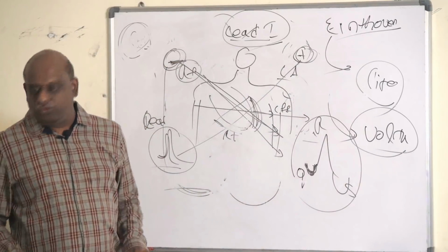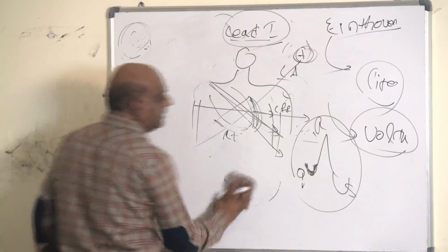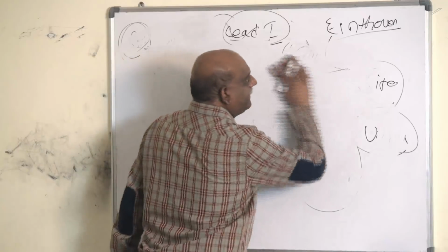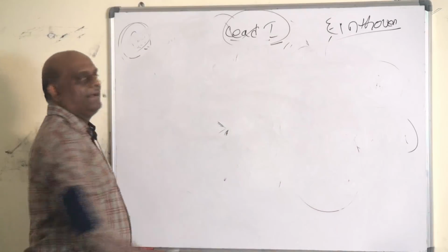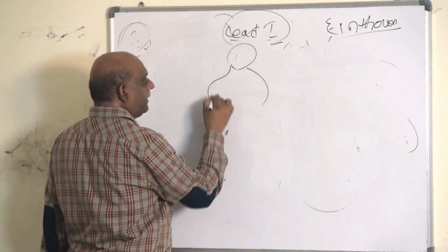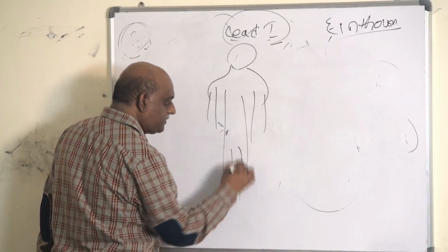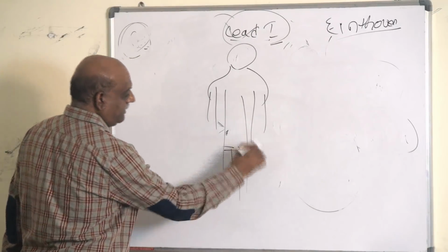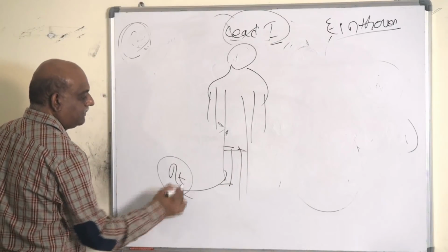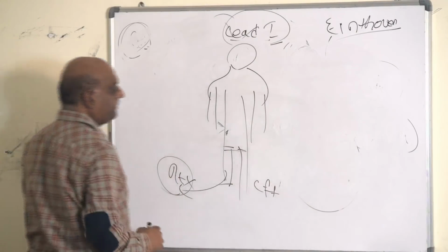Now, lead 1 story you know very well. Now, the next story is, how do you get lead 2? By now you got the full idea, probably what I am going to write. So, this is Einthoven's father-in-law. He has 2 legs. So, right leg is earthed. So, right leg is useless. So, he has the left leg.